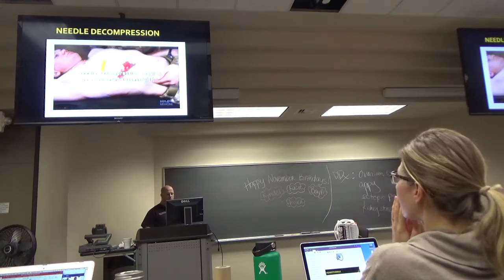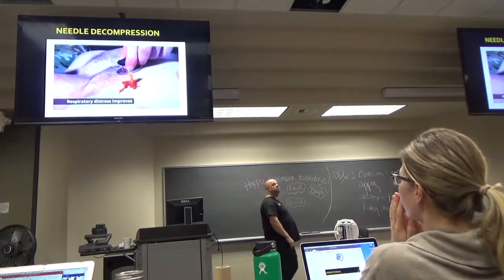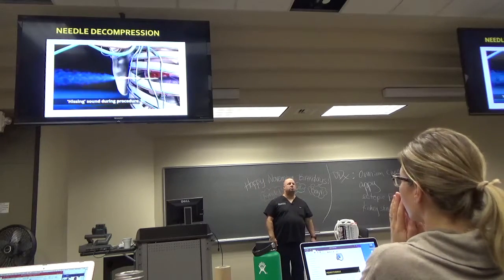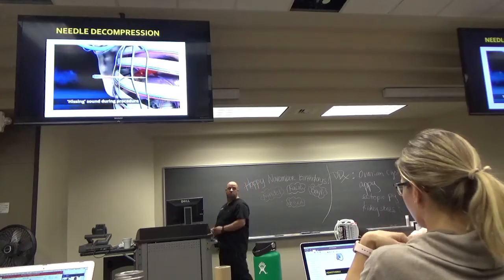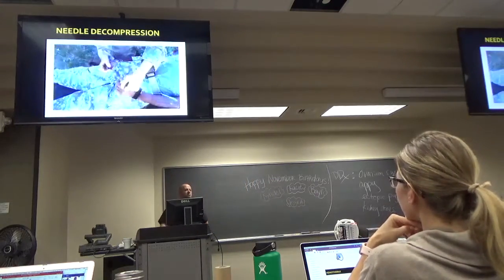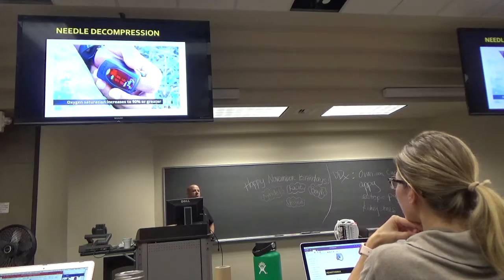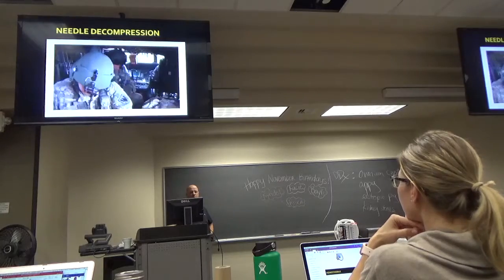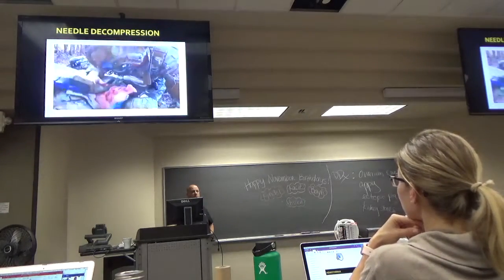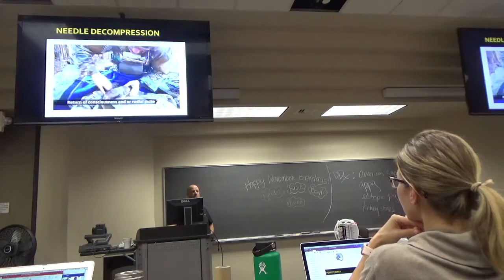The needle decompression should be considered successful if respiratory distress improves, or there is an obvious hissing sound as air escapes from the chest when the NDC is performed. This may be difficult to appreciate in high noise environments, or hemoglobin oxygen saturation increases to 90% or greater. Note that this may take several minutes and may not happen at altitude. Or a casualty with no vital signs has a return of consciousness and or a radial pulse.